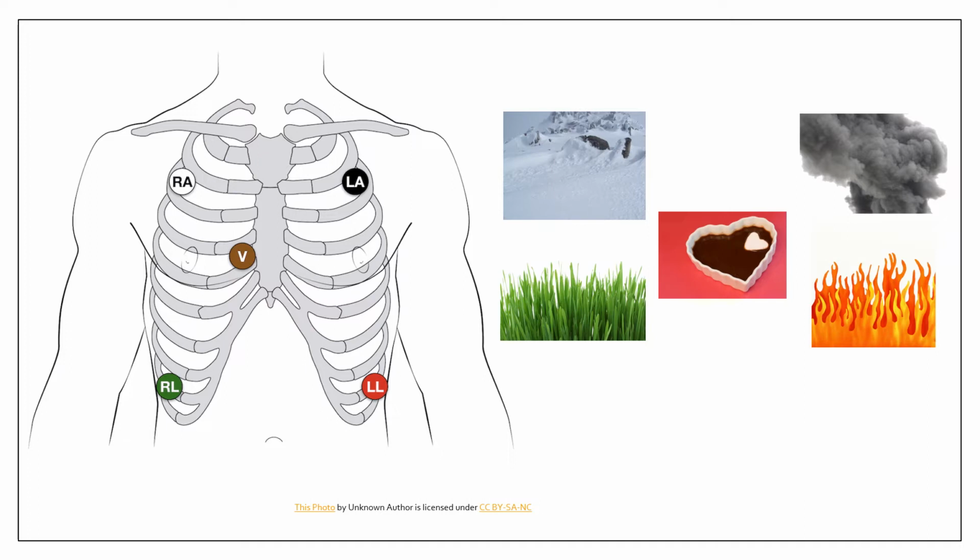So this slide is about 5-lead ECG monitoring, which is what nurses use most often at the bedside for continuous rhythm monitoring. In 5-lead monitoring, we place 5 electrodes on the chest. These electrodes allow the monitor to create multiple lead views, even though we only place 5 stickers. The goal is to get consistent, clear electrical signals from the heart during routine monitoring.